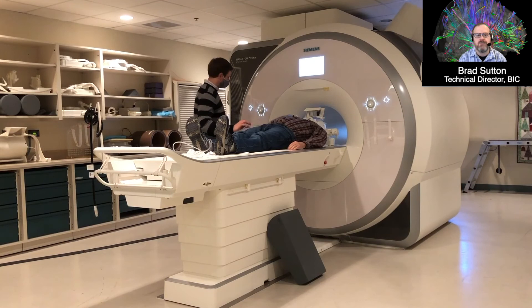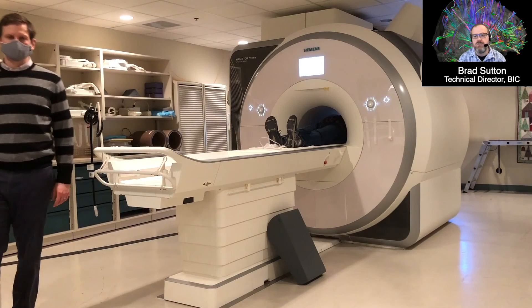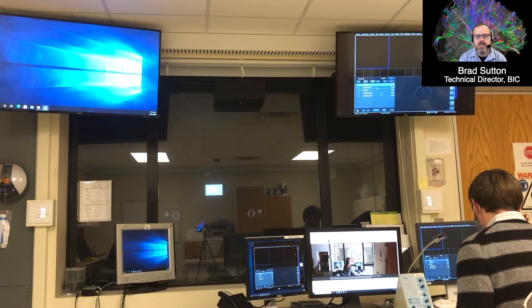Aaron is giving the subject a squeeze ball because it's a really loud scan. If there are any problems during the scan, squeezing that ball will alert him to stop the scan and come in. In the back of the room there's a video screen — you can see the glow off the ground — and that's how the subject will see the task being presented to them.